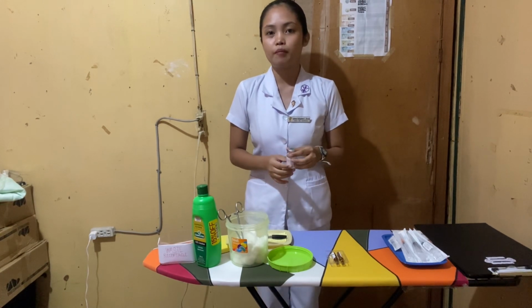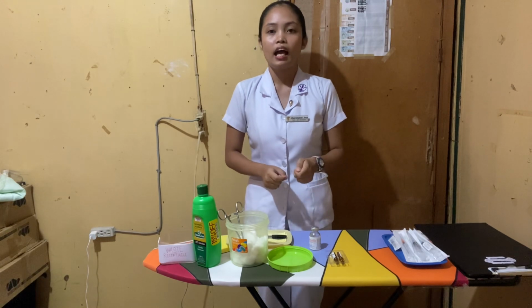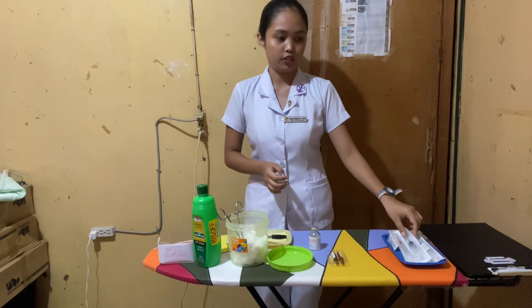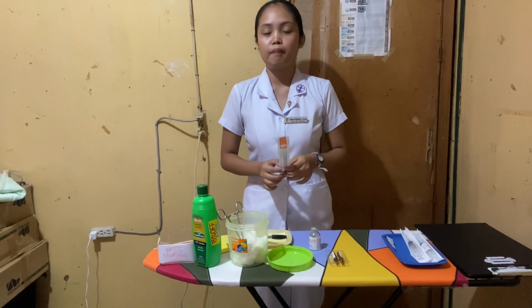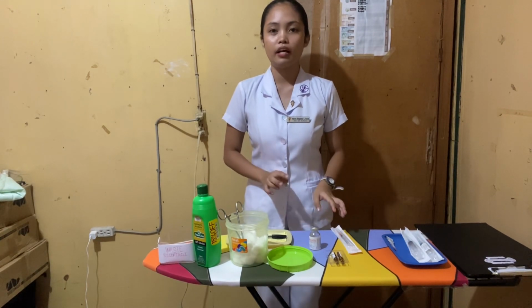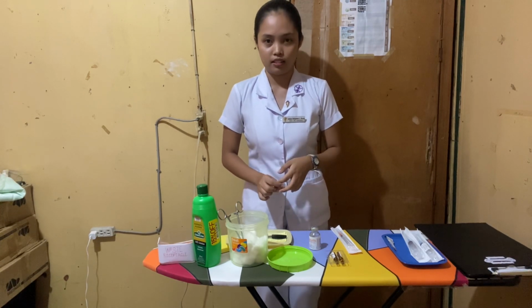After doing that, I'm going to prepare the syringe. I have here the tuberculin syringe, ideal for skin testing and intradermal injection. I'm going to open it by the pocket. It is important to remember that we can only touch the barrel and the plunger of the syringe to avoid contaminating the needle.